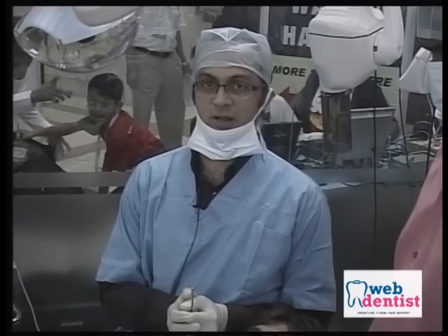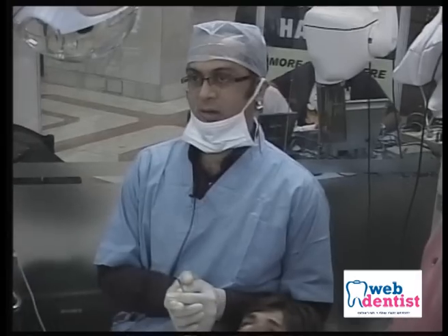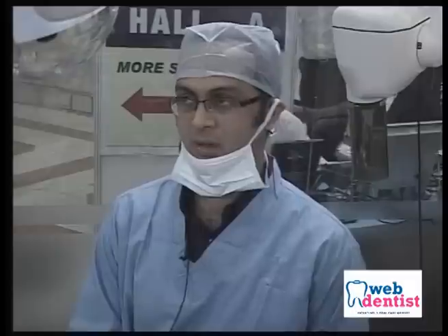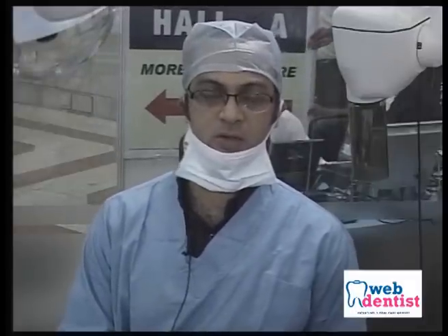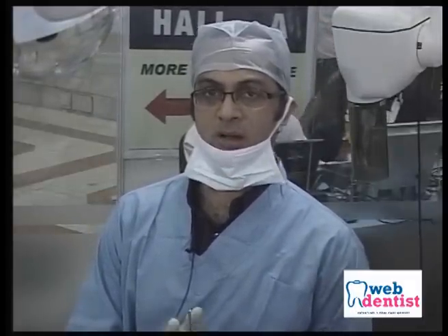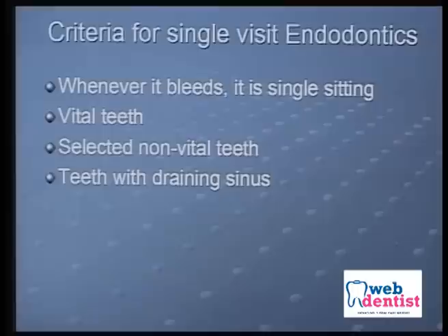Today we are taking a procedure that is single sitting or single visit endodontics. The tooth in question is the maxillary left second premolar. The local anesthetic technique which we use for the maxillary region is only buccal infiltration. It is vital, so it has to go through in a single visit. We should not be calling the patient again and again. I have already given anesthesia.